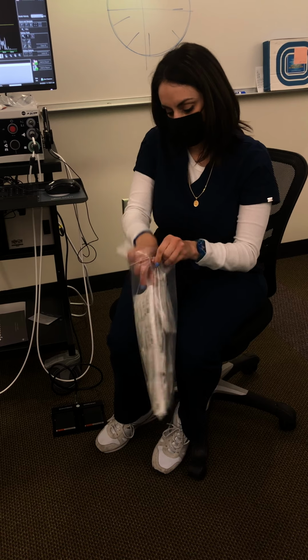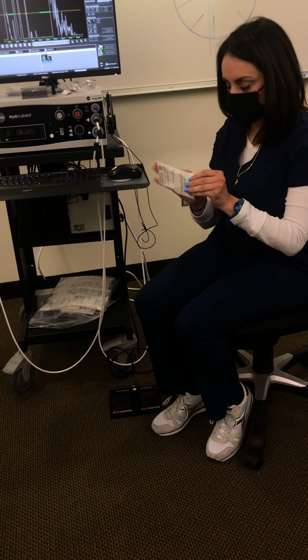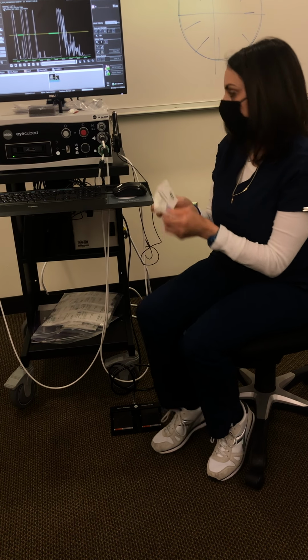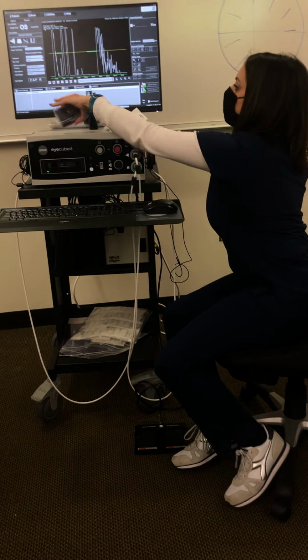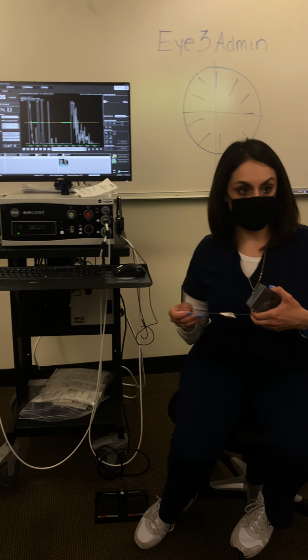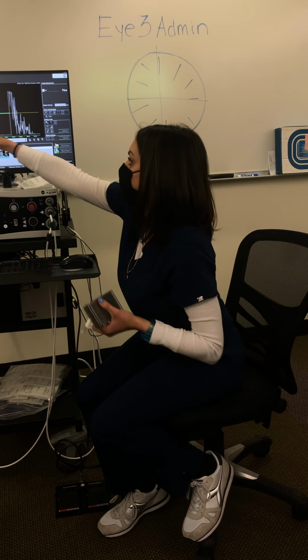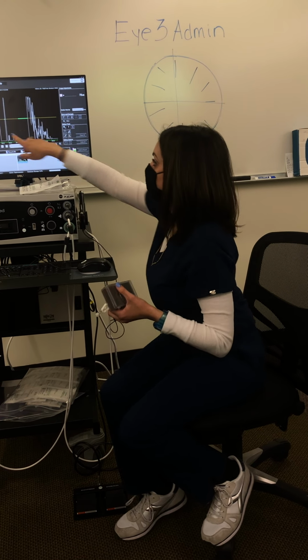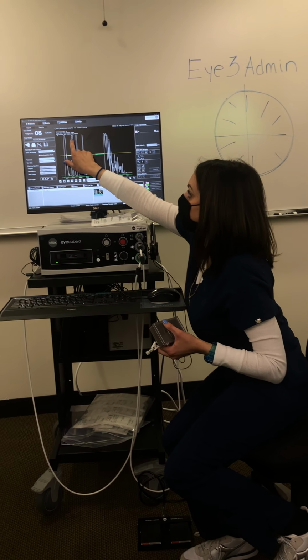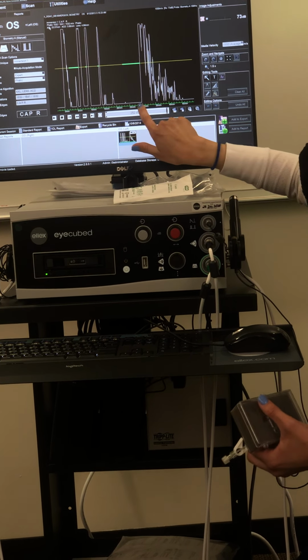So just to show you how to set this up, we don't have a bottle of BSS, but we can use that just to show how it looks. Do you mind grabbing that eye lock? Thank you. What you're seeing here, if you think about that horizontal axial from the B scan, you're gonna think about the front of the eye to the back. The only difference here, this is the transducer, this is the saline, this is the cornea, anterior lens capsule, posterior lens capsule, vitreous, and retina.